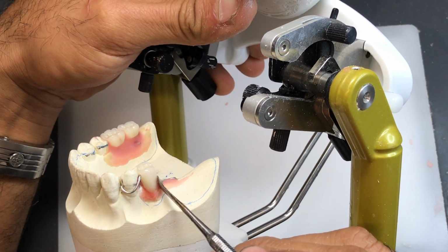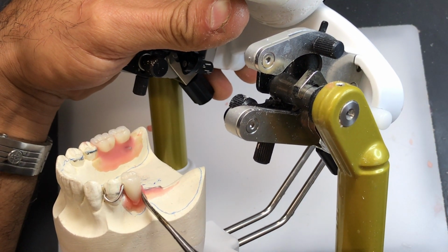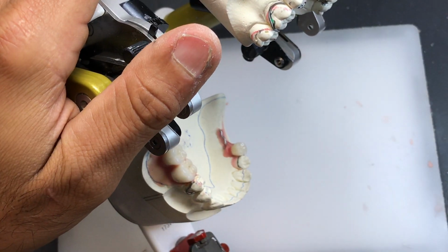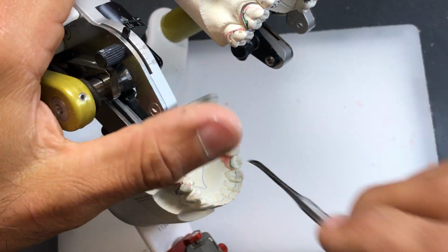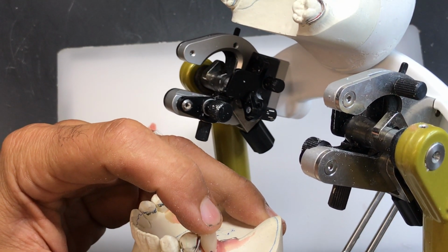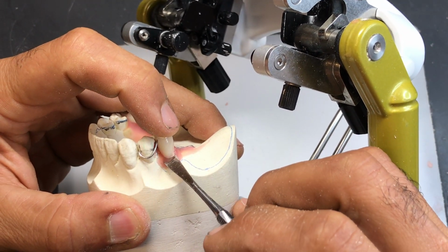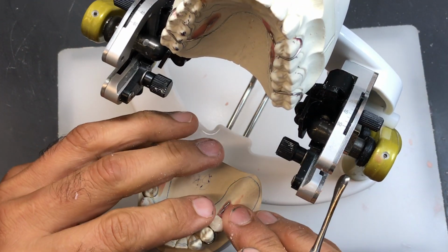I'm just going to soften up the wax around this tooth to get it into an ideal position. It's not there yet. You can clearly see that the long axis of 3-5 is somewhat tilted towards the distal, so I'm just going to correct the position of the tooth before I assess the tooth against the opposing. Wax is getting a little bit hard. Okay.